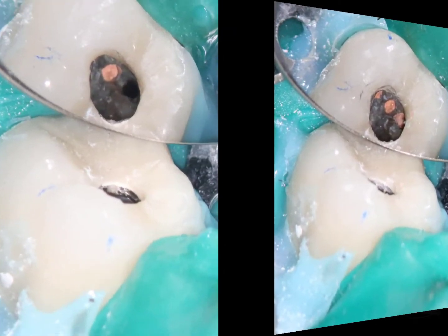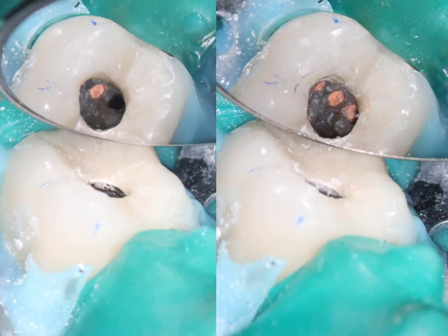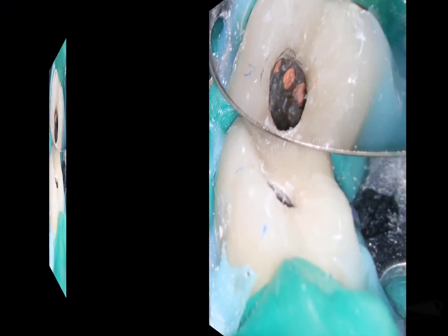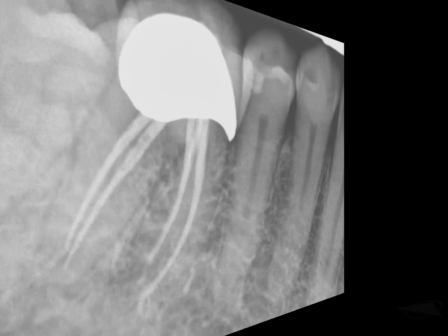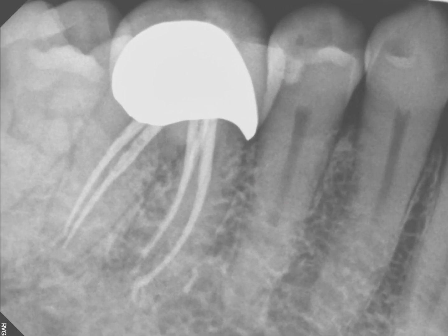The tooth was re-accessed, and the previously untreated mesialingual canal was located, cleaned, and sealed.